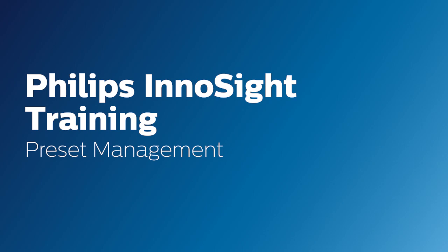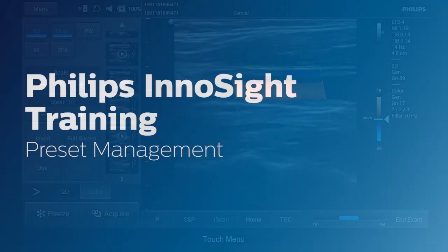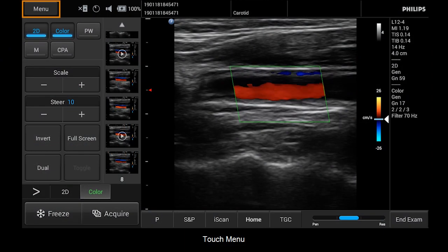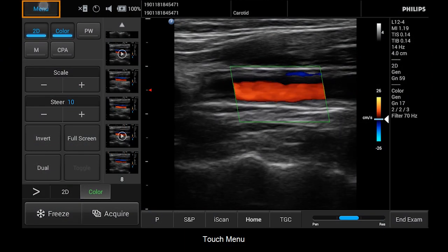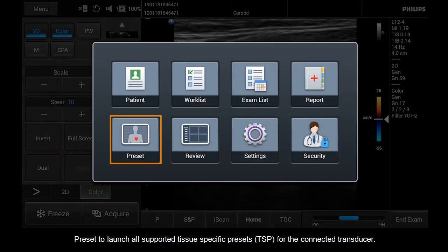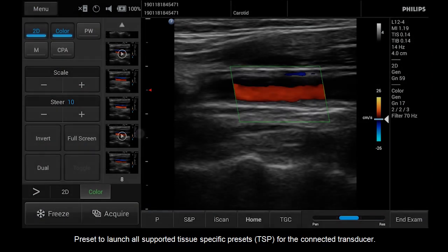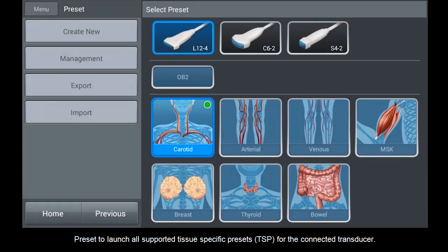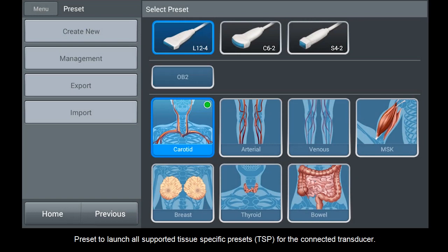Hello, today we will look at how to manage presets on your InnoSight system. Touch Menu, then Preset, to launch all supported tissue-specific presets (TSP) for the connected transducer.